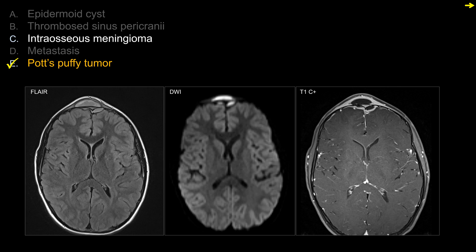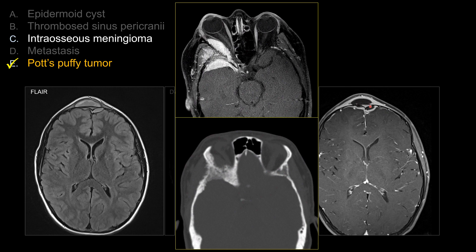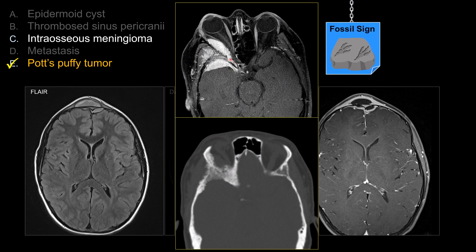For choice C, intraosseous meningioma: intraosseous meningioma should be solidly enhancing, like any meningioma. While cystic change can occasionally occur, it is very unusual to have a meningioma without any central enhancing component. This example shows a meningioma engulfing the greater wing of sphenoid and the lateral orbital wall with relative preservation of the surrounding bony structure — described as a fossil sign, as if a preserved fossil exists within surrounding bone. On CT, meningiomas also tend to elicit hyperostosis with expansion of adjacent bone. This does not look like a meningioma.